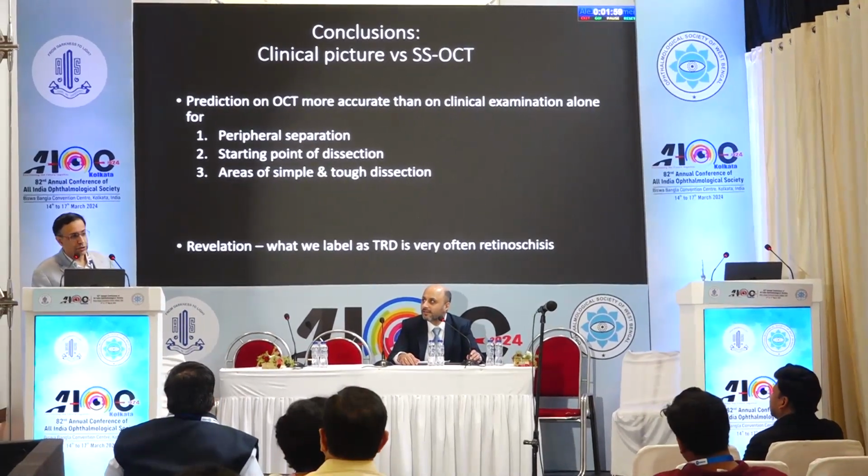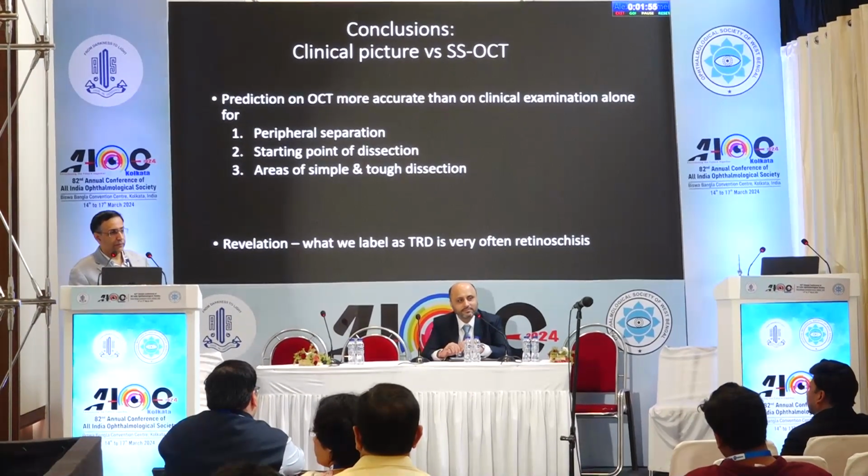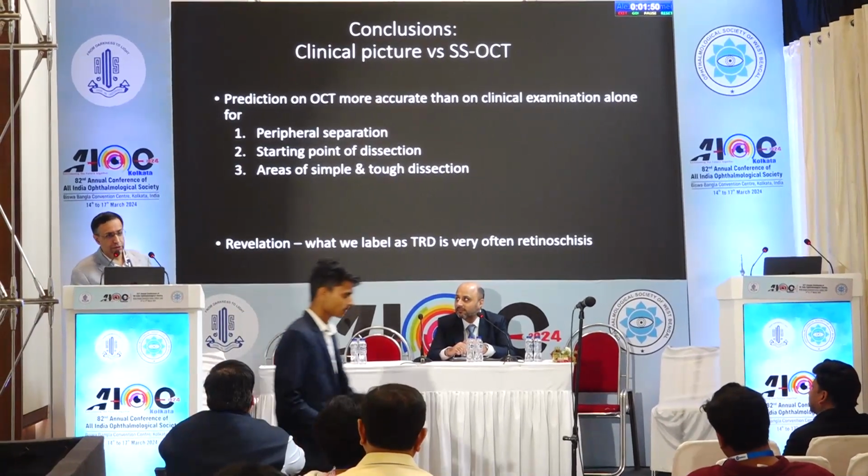We don't use it so much in our diabetics. I use it in all the PVR cases, but in PDR somehow we don't use it so often. I mean, it is a personal choice. I think many people have shown that it's very useful.